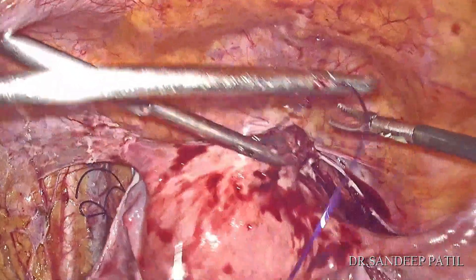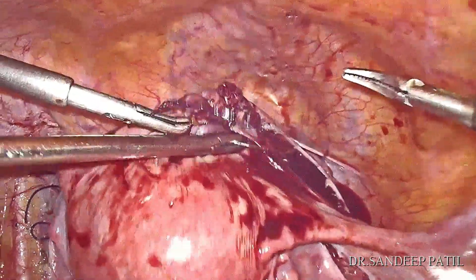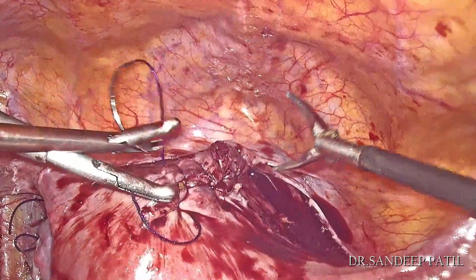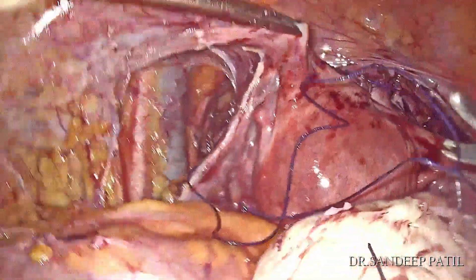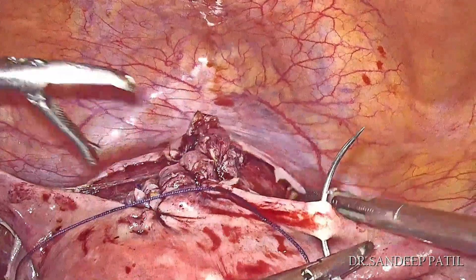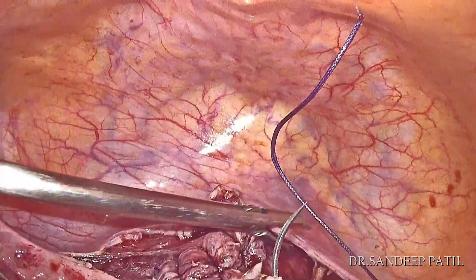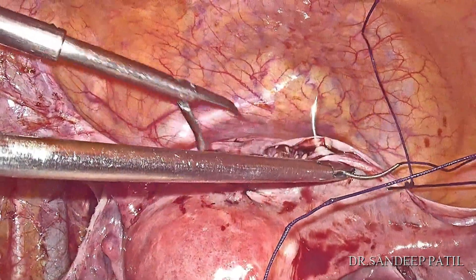In this case, the defect was small so single layer suturing was done. Once this is done, hemostasis is confirmed, uterine artery ligatures are removed, and NS wash is given. The UV fold of peritoneum is sutured with vicryl number one continuous running sutures.